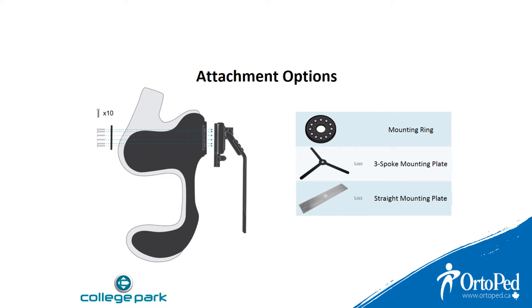There are several options in mounting the Axis shoulder joint to the socket. Number one, the mounting ring which is included with the shoulder — this is used for definitive sockets. Number two, the three spoke mounting plate used in test or definitive x-frame style sockets. The arms can be easily bent into position.